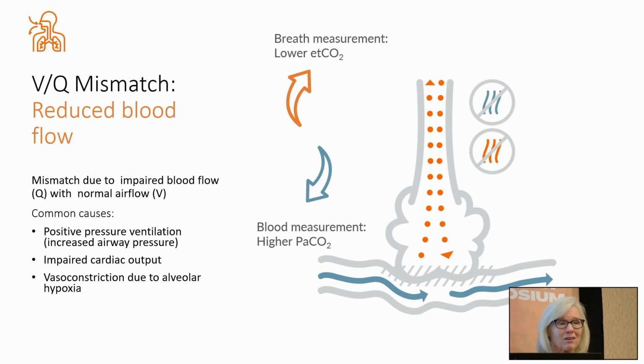We were talking to the therapists, and they were basing it on what they thought was going on with the patient. The therapist who had the patient said, I think it's 80. And the other therapist said, I think it's closer to 50. This guy had pneumonia, by the way, and when they saw that 80 on the transcutaneous, they went ahead and bumped up his respiratory rate. I think it was on 12, and they bumped it up to 14. They'd also noticed that his tidal volumes were trending lower.